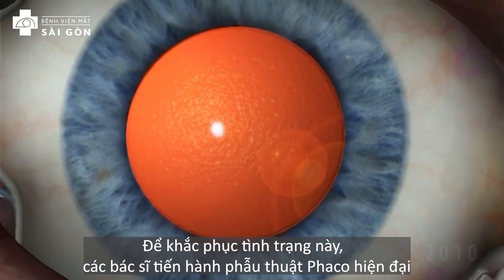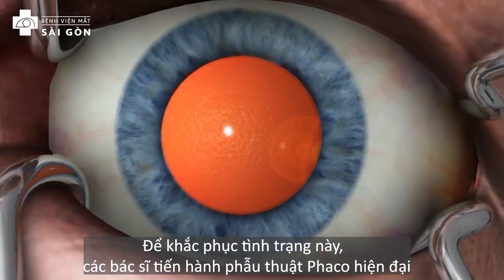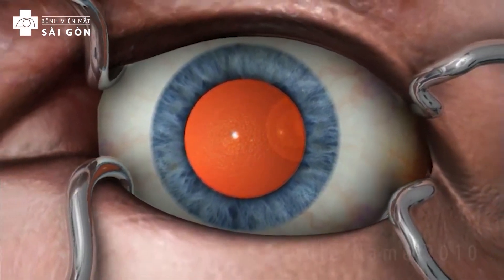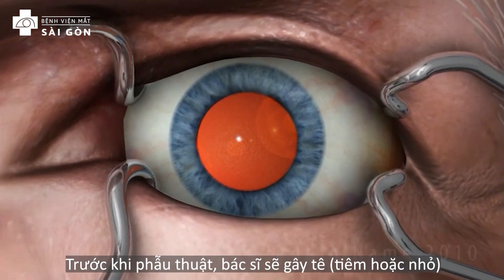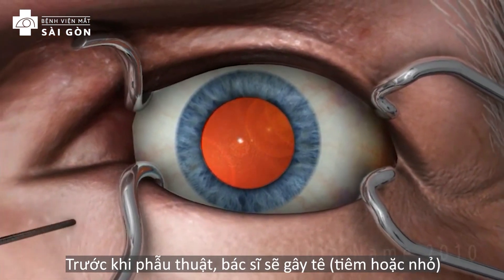To correct this, a doctor may recommend phacoemulsification cataract surgery. Before the procedure, the surgeon numbs the area with anesthesia.